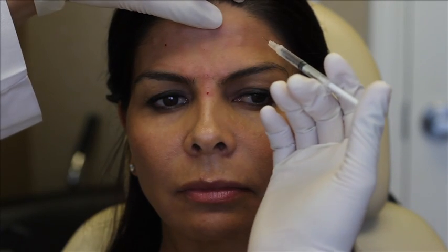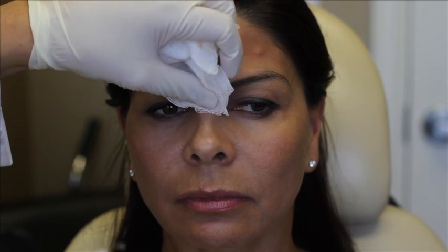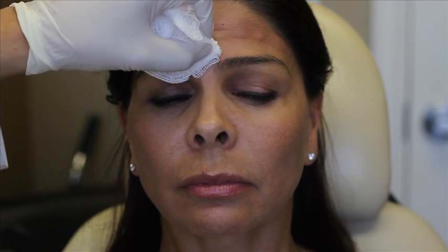So now typically this doesn't hurt much. You can use some numbing cream to help with that, but most patients don't really want anything.